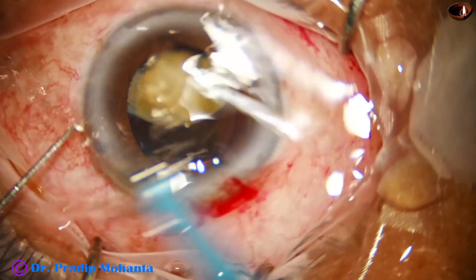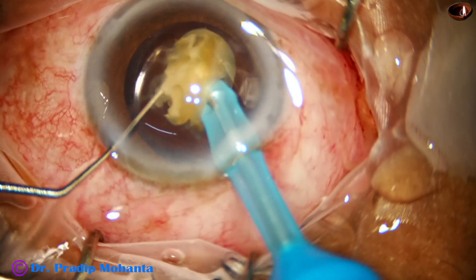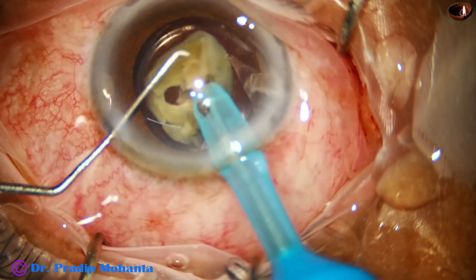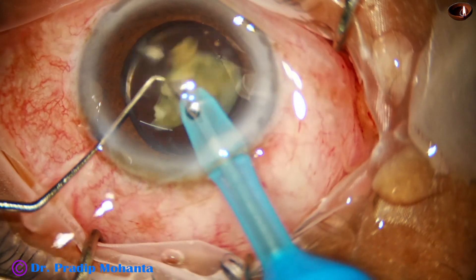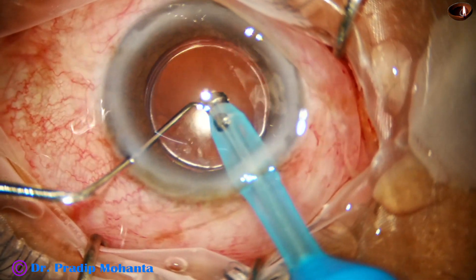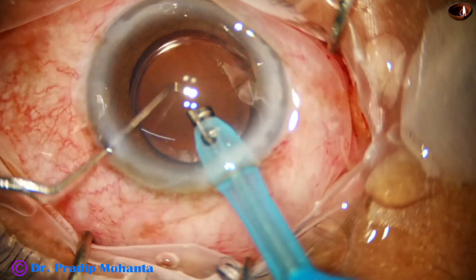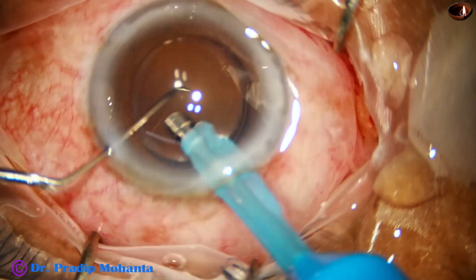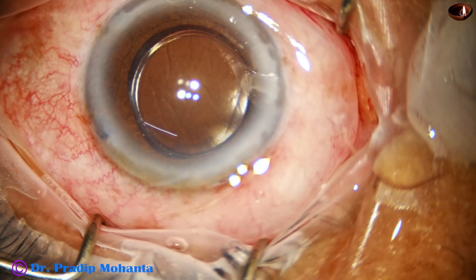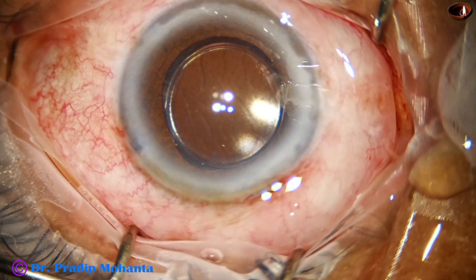The last nuclear fragment is quite large and must be emulsified with precautions. The capsule must not be touched, and ultrasound must not contact the IOL optic. The phaco needle must remain in the iris plane. The lens has gone far back and is close to the posterior capsule — care is taken not to touch the IOL or the back of the cornea.